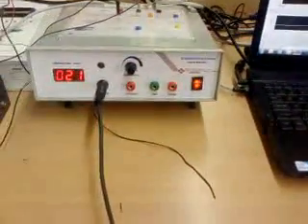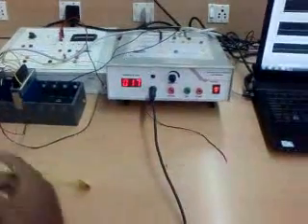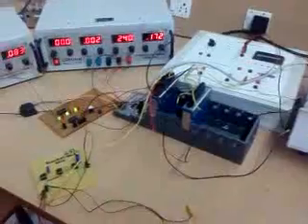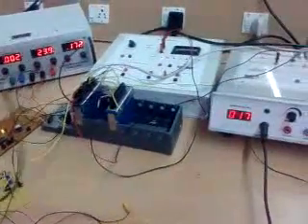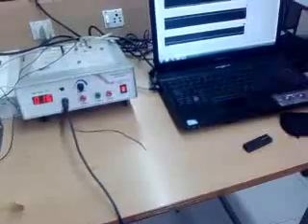Next, we have given provisions for heart rate simulation and oxygen saturation simulation. Heart rate simulation will give an accurate result, and even in the case of sleep apnea, in some cases it's not because of your breath, sometimes it's because of your heart also. So in that case it will detect any abnormal activity of the heart, and same in the case of oxygen saturation. So we have given provisions over here, and based on all these three values we can detect the apnea.